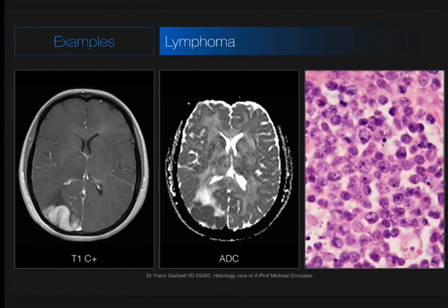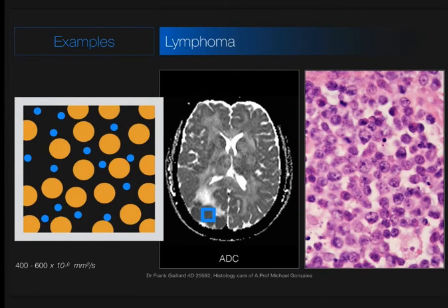A final example is lymphoma. On T1 post-contrast and ADC maps, a patient with cortical lymphoma shows a vividly enhancing tumor involving the cortex with strikingly low ADC values, due to high cellularity. These are small, round blue cell type tumors, exhibiting similar diffusion restriction to medulloblastoma and PNETs — lots of small blue cells tightly packed together, reducing the extracellular component. On this image there is also vasogenic edema, and where there is influx of additional water molecules spreading out normal axons, we have facilitated diffusion.